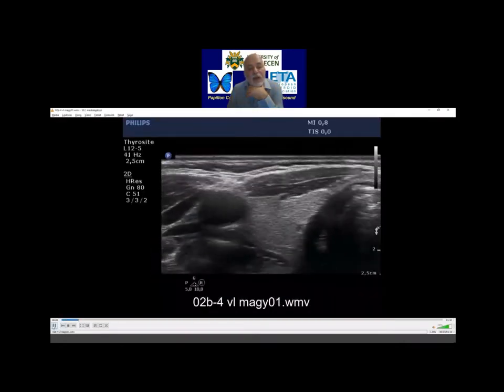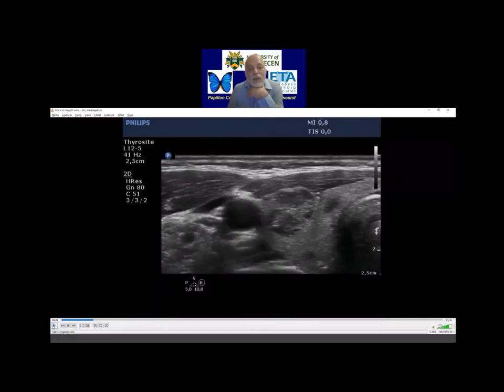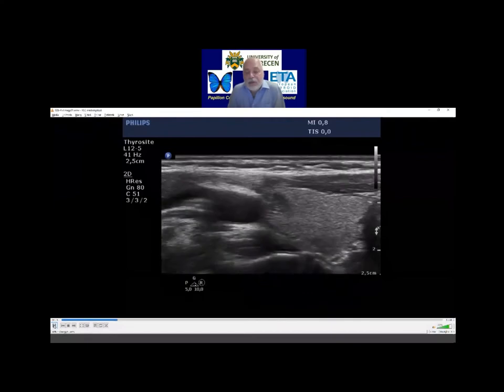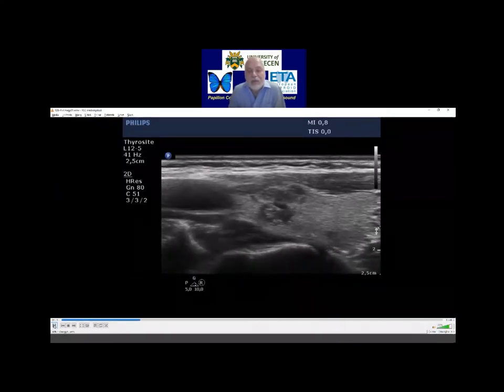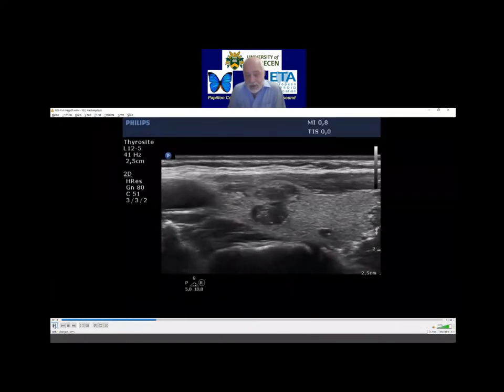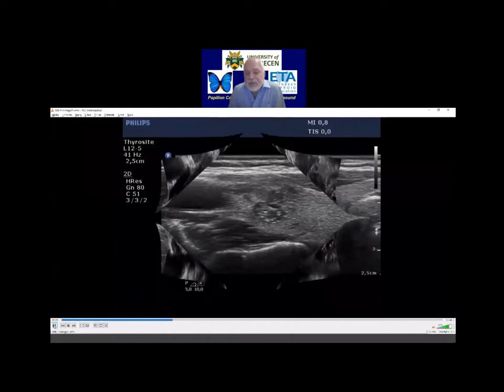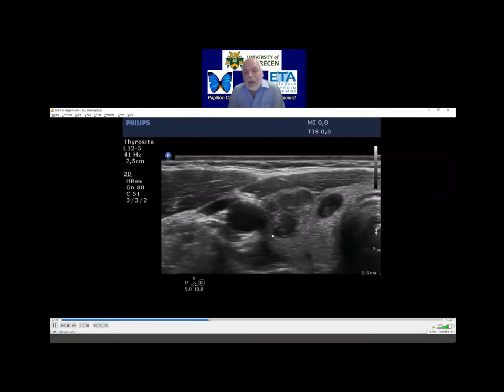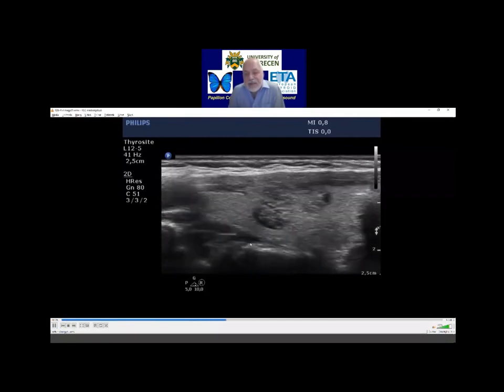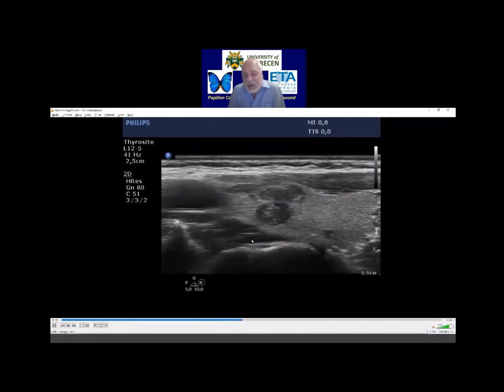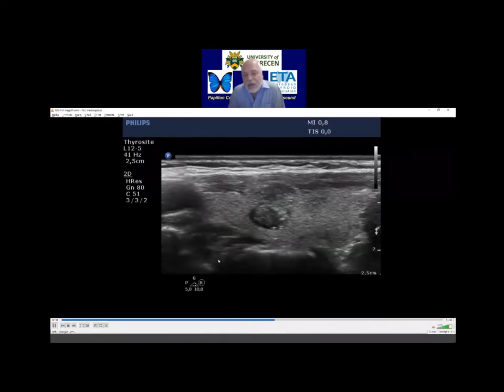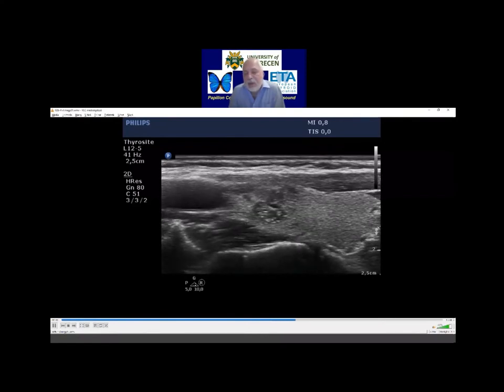Now see it again. We had three nodules in the right thyroid lobe — here, here, and here is the third one. I think that these intranodal echogenic figures are also clearly backfall cystic figures. This is a much more difficult case than the previously presented one because there are only tiny cystic areas. But be aware: lines and granules are synchronously present. Occasionally a micro-calcification can be a bit elongated, but such quite large linear forms do not occur in the event of micro-calcification.